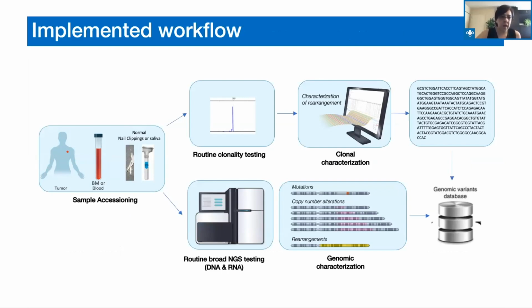In general, we request for each patient to have their tumor sequenced by our MSK-IMPACT assay, which looks for genetic mutations in 400 related genes. And these are genes that are associated with hematologic malignancies. But we usually also ask for bone marrow, and we ask for normal controls, which are usually nails or saliva, to be able to sequence and know that all of the mutations that we have are being assessed specifically for somatic alterations and not variants that could be germline.